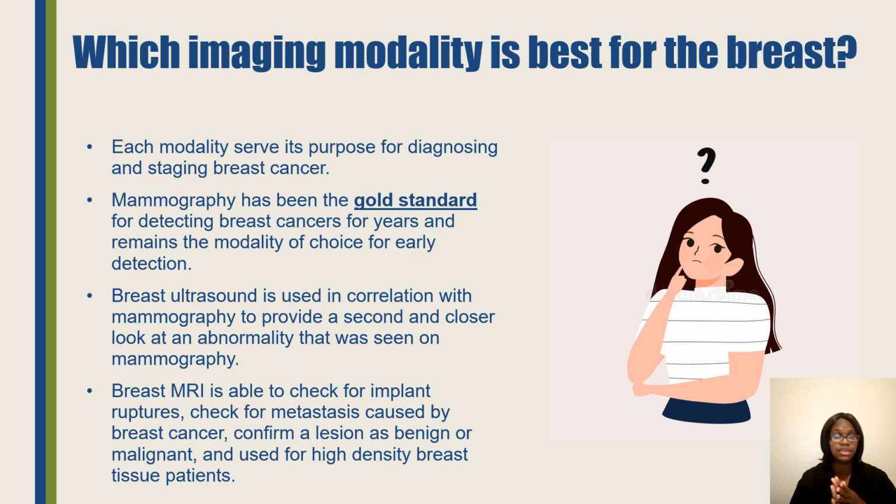But the mammography machine is number one whenever a patient is coming in for any type of breast related concerns, especially if it's a screening mammogram, or if they need a diagnostic mammogram, a lot of the time the doctor will order a diagnostic breast ultrasound as well if it's needed.